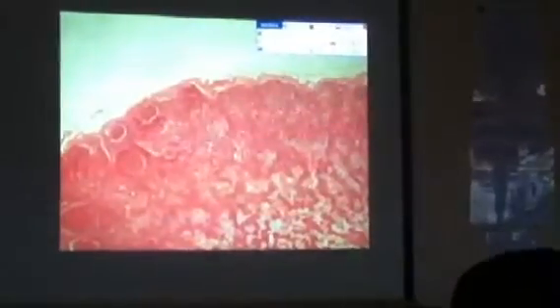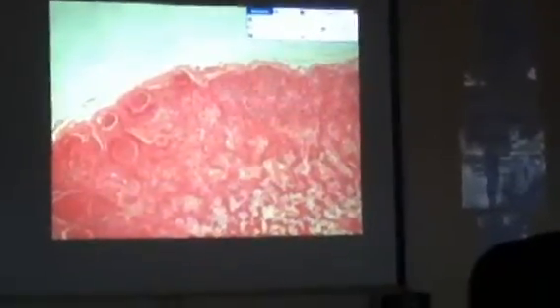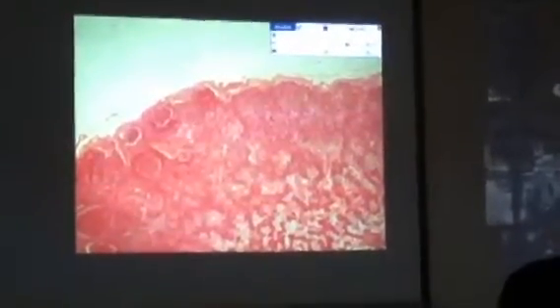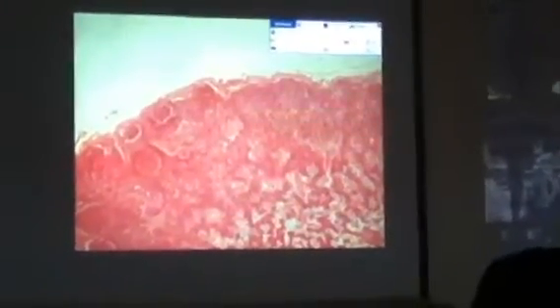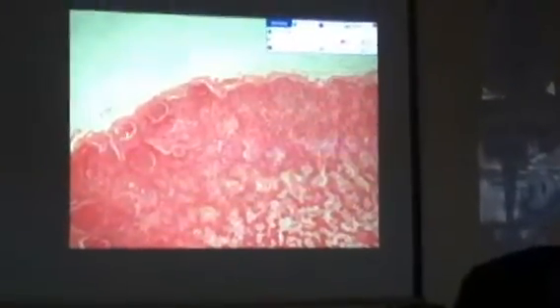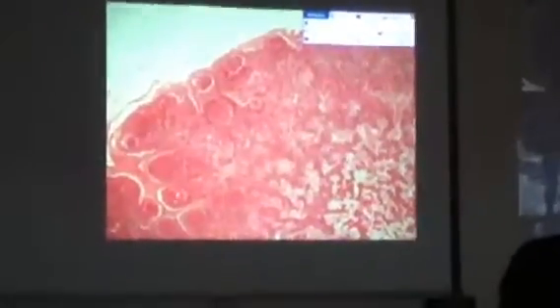The cortex has a harder consistency as compared to the medulla, because it is almost completely filled with lymphocytes. Many of the lymphocytes form those circular to oval structures. How do you call those structures pointed? Lymphoid nodules or lymphoid follicles. Yes, lymphoid nodules or lymphoid follicles.